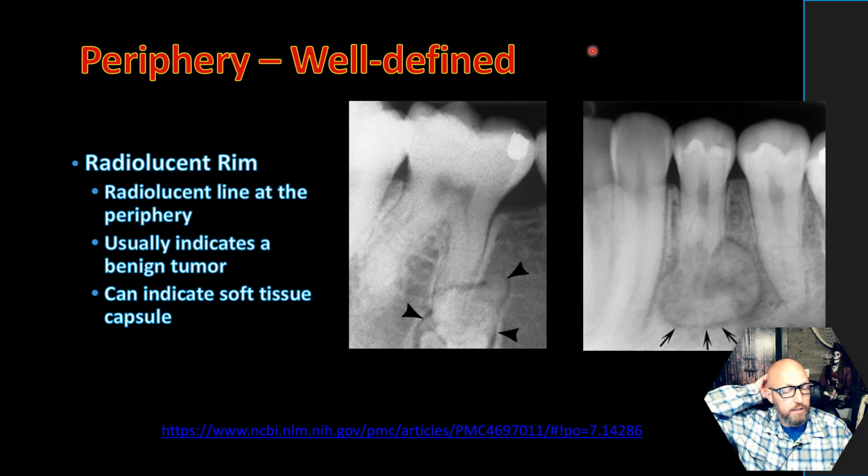I will do a lecture that's specific to opaque lesions that have radiolucent rims. So I like dividing up my lectures by the radiographic presentation, because that's kind of where you're going to start, right? You're going to go through this lecture and hopefully be able to describe. Then you're going to say, okay, I described something that's well defined. It's radiopaque internally, but it does have a radiolucent rim. Now let's go to that lecture where Dr. Mecham talked about those lesions with radiolucent rims around it. So hopefully that helps out coming to a proper differential diagnosis.